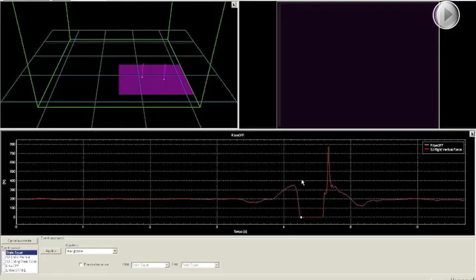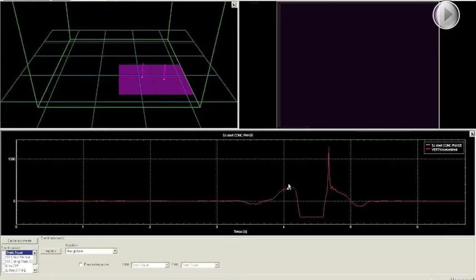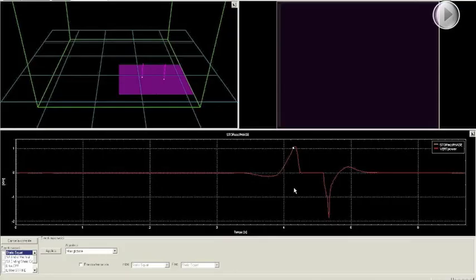Same thing for the squat jump, so right toe off, right foot strike, start of the concentric phase. In this case of the squat jump, we do not have the first eccentric phase because we already start in a loaded position. So here is the start of the concentric phase, and here is always the stop of the eccentric phase. Okay, everything is set. We can save the data.